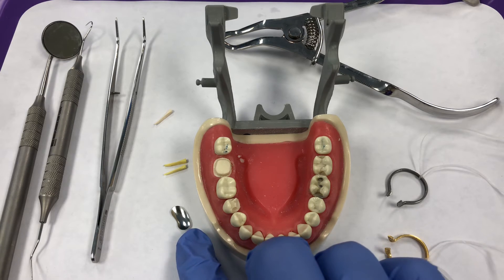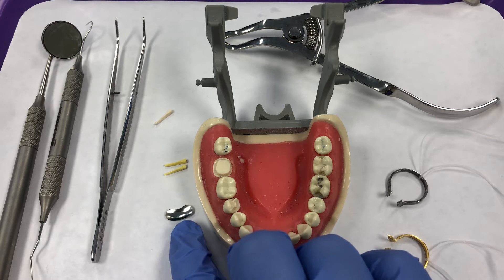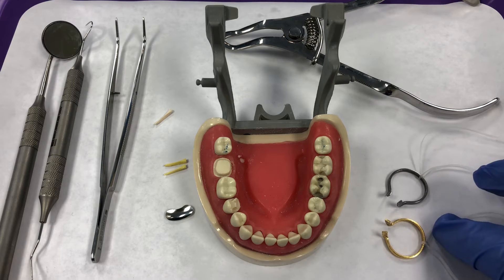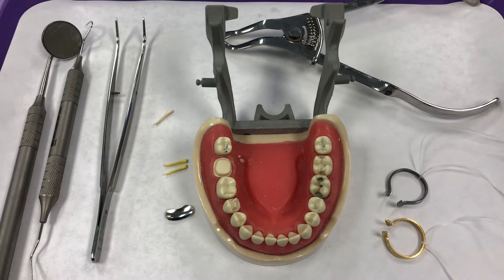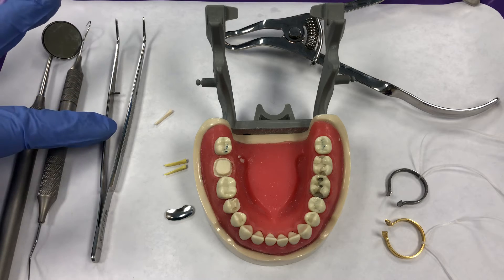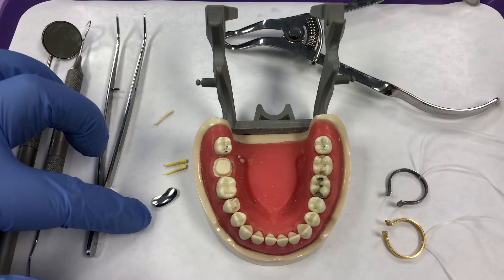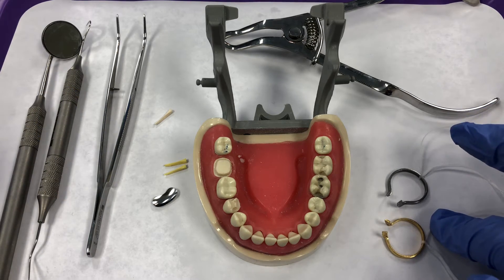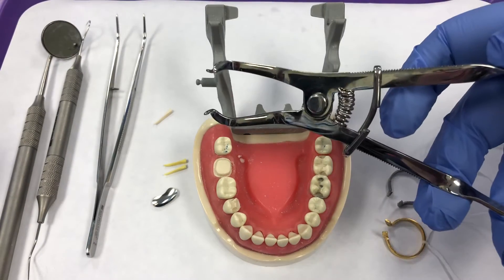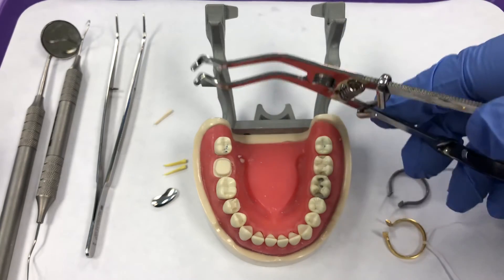They're going to use these sectional matrix pieces. Usually they're kidney bean shaped, and they're going to use tension rings to hold that matrix against the tooth. For my setup, I have a mirror, explorer, and cotton pliers. I have a variety of wedges, my matrix, and my tension rings. And this here is a forceps, very similar to a dental dam forceps, that will allow me to place the tension rings against the tooth.